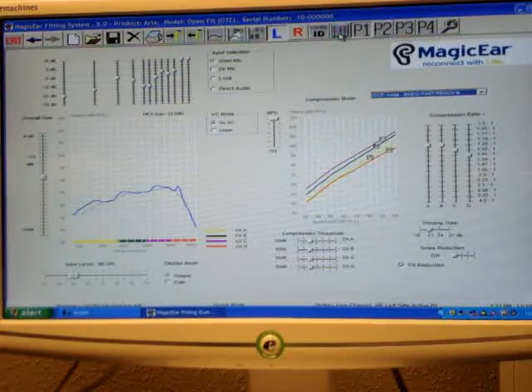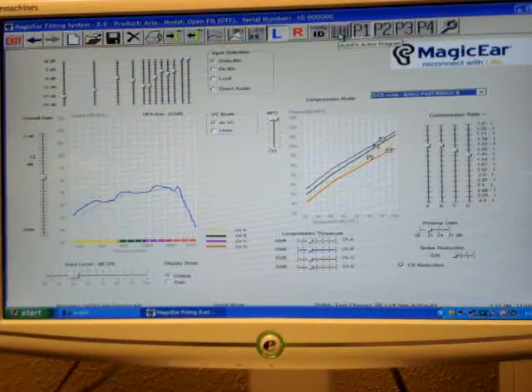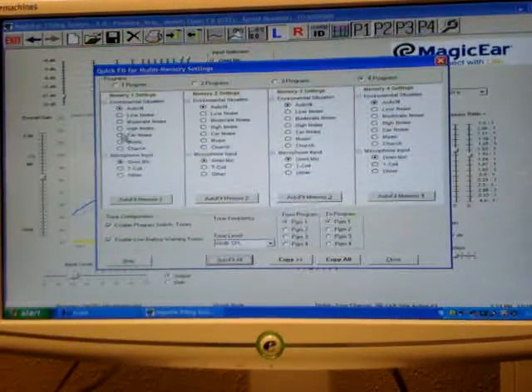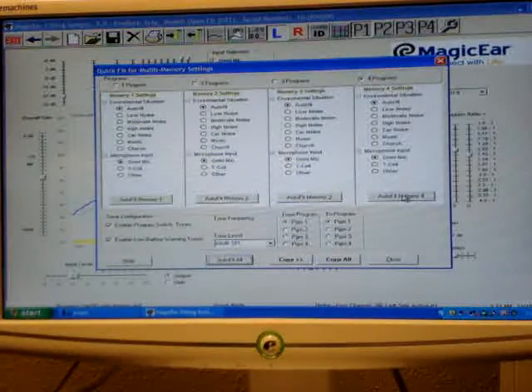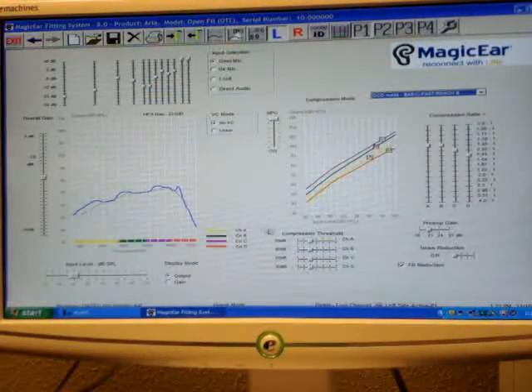And then come to this tab for the auto fit. You click on the auto fit and it will give you the choice of auto fitting just memory 1, 2, 3, or 4 in different environments. So memory 1 will fit for normal. Memory 2 we can do for a low noise setting. Memory 3 for a higher moderate or high noise. And memory 4, if they like to listen to music, we can set it to music. Auto fit all the memories.